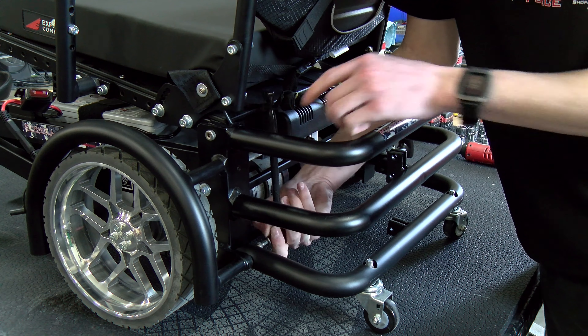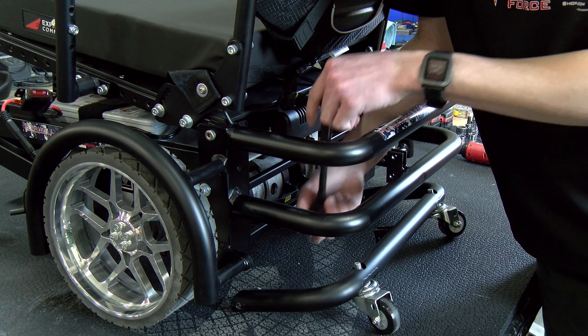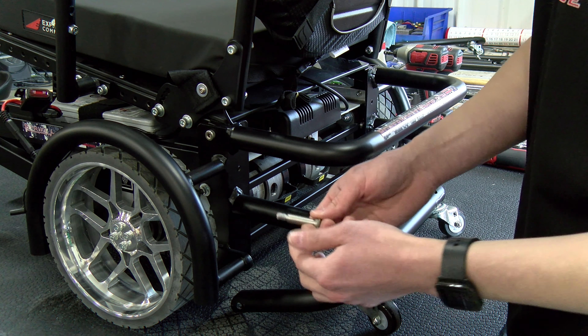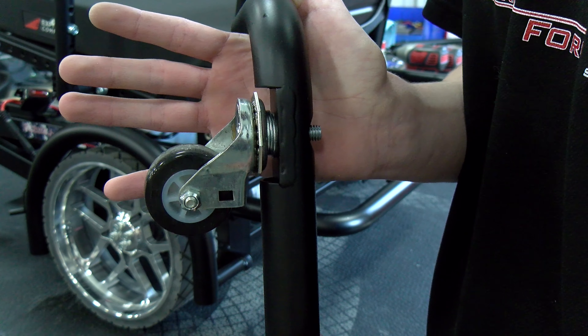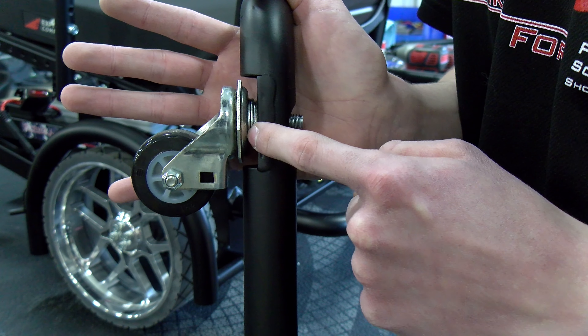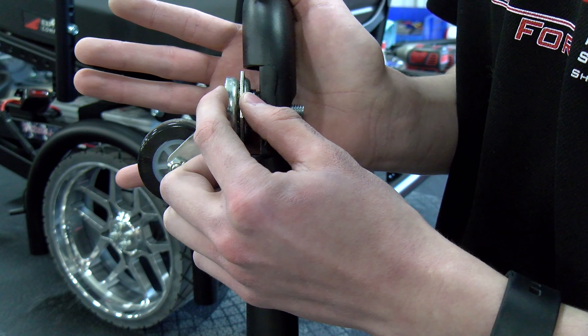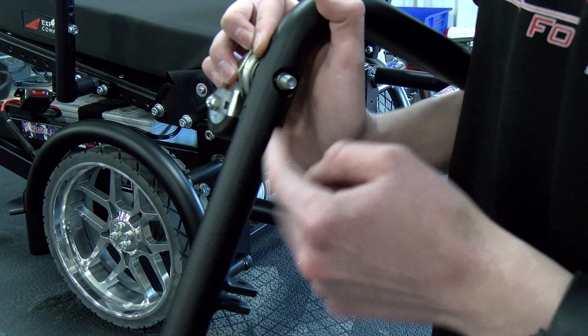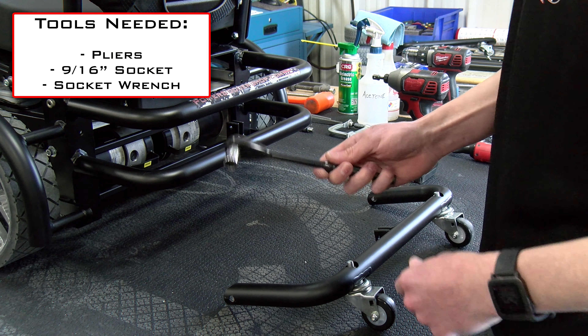Now that we have both of those shoulder bolts taken out, you should be able to completely remove the anti-tip bar from the chair, and then we'll move into some close-ups and I'll show you how to add washers to the rear casters. You can see that we're using three washers as a spacer here. We're going to need to grab onto this section with the pliers and then we'll also need to remove this nut with a 9/16 inch socket wrench to remove the caster wheel.